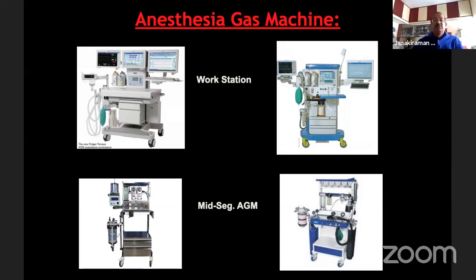The mid-segment has no monitoring at all. It's only a delivery unit. That means the doctor does the calculation and takes it for granted that the set oxygen percentage is going to the patient, which may not be true.